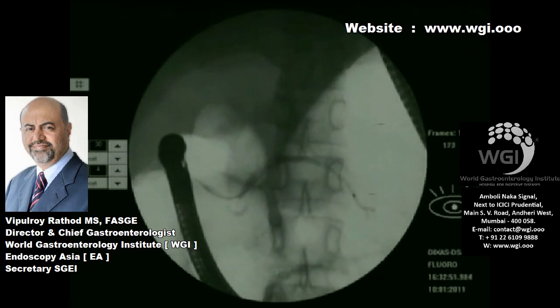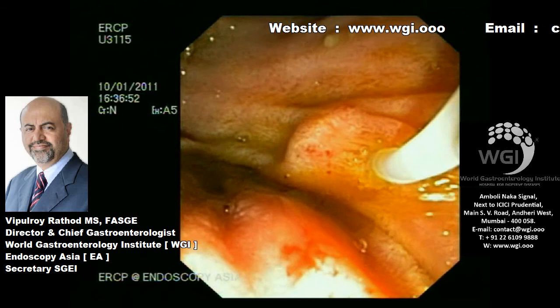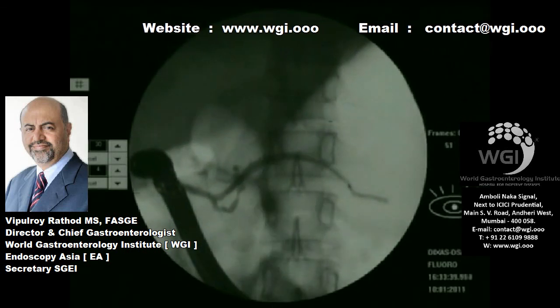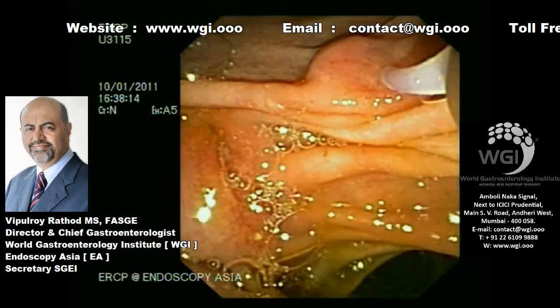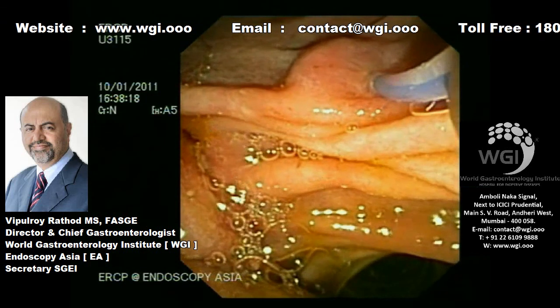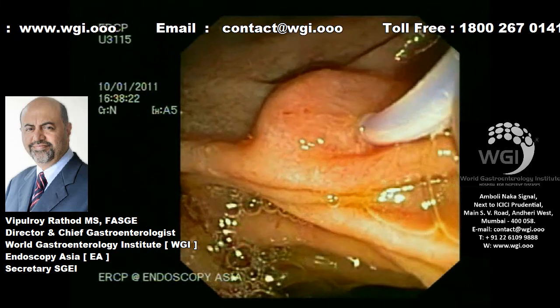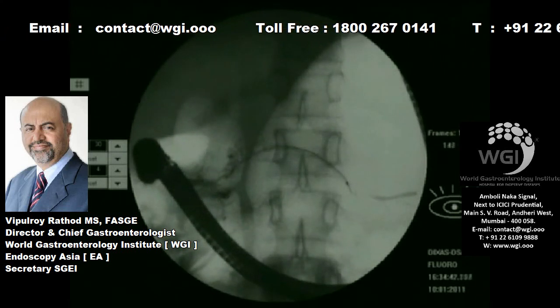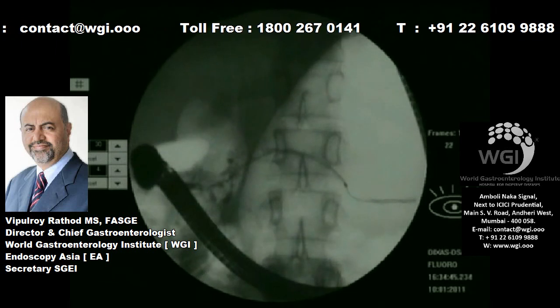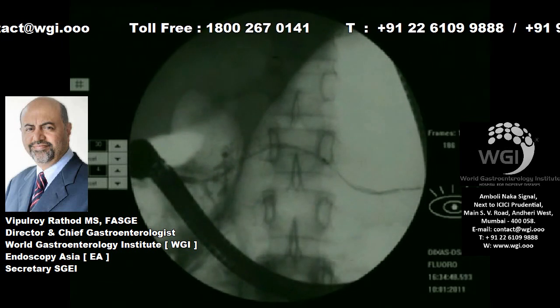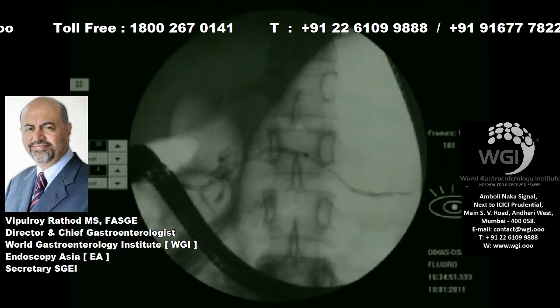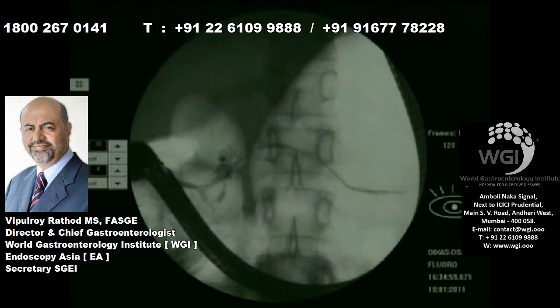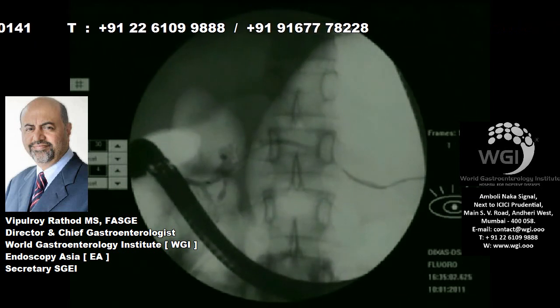Once we are in the pancreatic duct, we will obtain a pancreatogram. You can see the communication there and how complicated the anatomy of the pancreatic duct is. Therefore, leaving a small stent through the minor papilla into the main pancreatic duct will obviate the need for major intervention. This will ensure effective ductal decompression. We are leaving a guide wire after exchanging the Terumo with a stiffer wire on fluoroscopy.